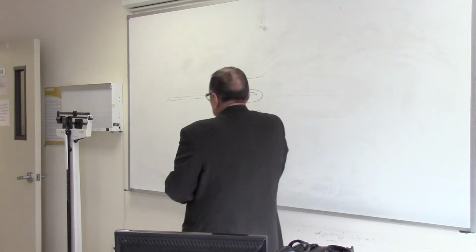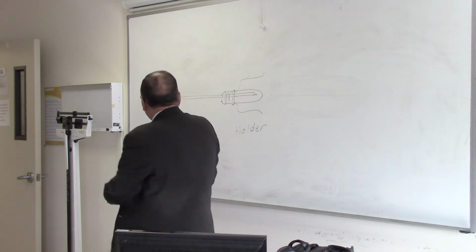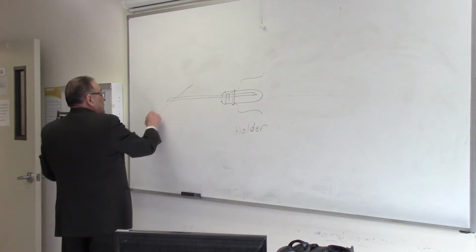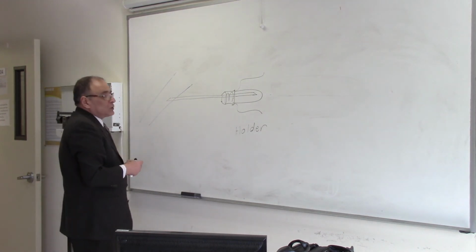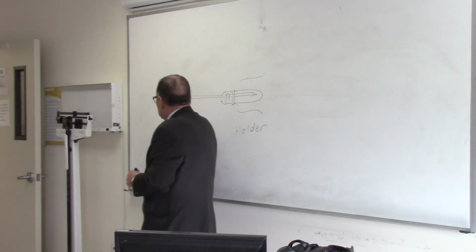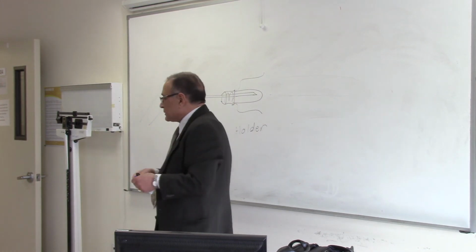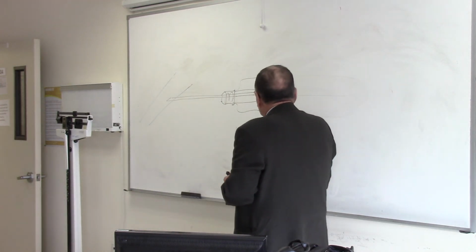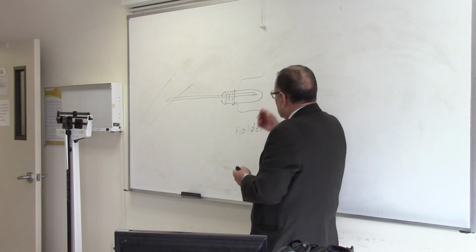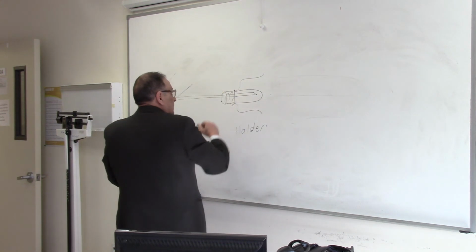And you start. When you put the needle inside the vein, just make sure the bevel is up. Before you use the needle, make sure the bevel is facing up, right? Very good. And then you start to press the tube here.